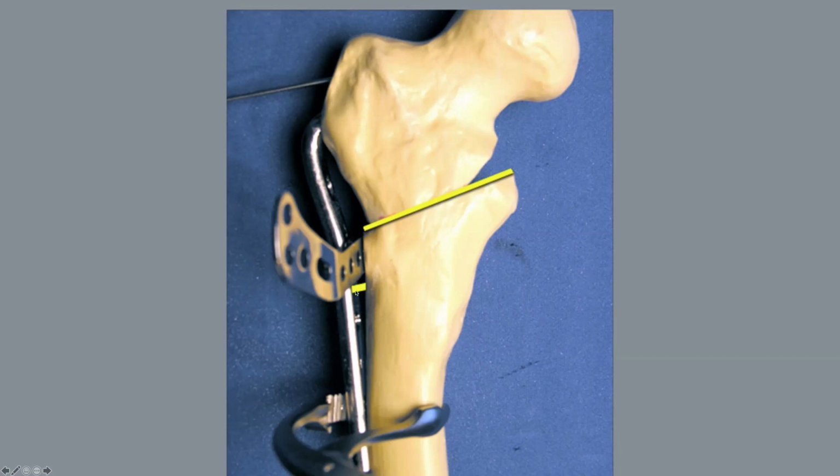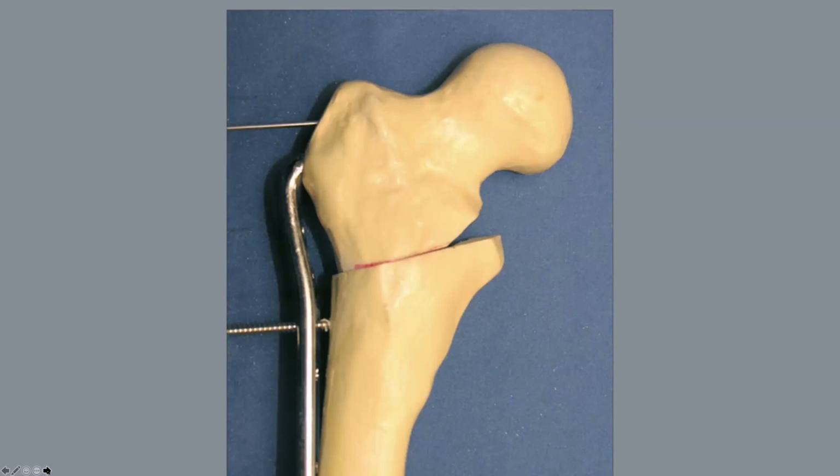So what you want to do is create this little area here of offset and use a small block of bone, a small instrument, something that will give you this offset. And then the distal end of the plate you see is against the bone already, and you're going to place a distal screw in. Now, most of the time it's indicated. A lot of people put in just a unicortical screw. Some people will put in a bicortical screw, but a unicortical screw will work. And then you'll be able to remove the thing that is creating that gap between the plate and the bone. You're going to place a screw in there.